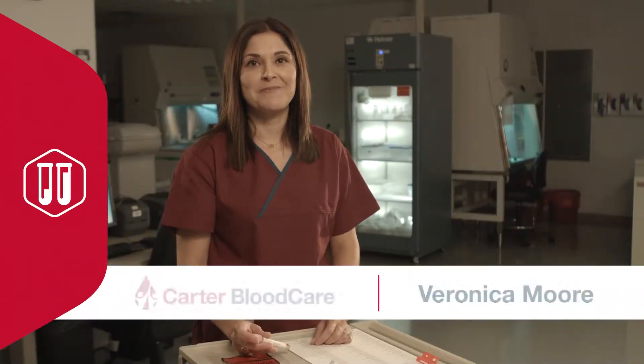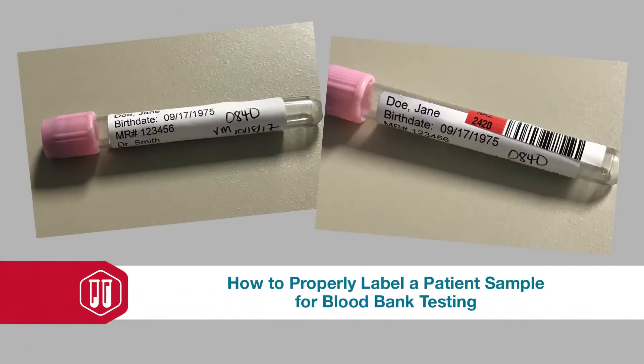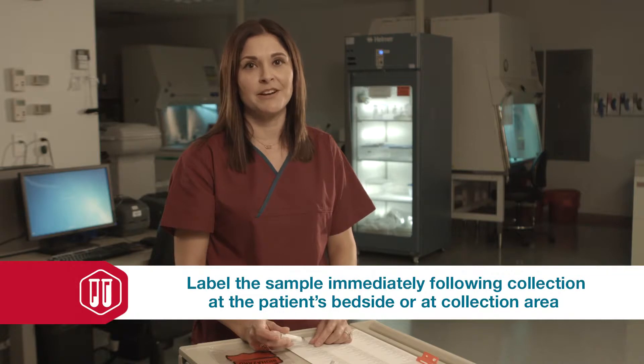Hey there, thanks for joining me. My name is Veronica and I'm with Carter Blood Care. Today I'm going to show you how to properly label a patient sample for blood bank testing. The majority of samples required for blood bank testing need an EDTA tube, which is commonly known as a purple or pink top. Please remember that labeling a patient sample should be done immediately following collection at the patient's bedside or in the collection area.